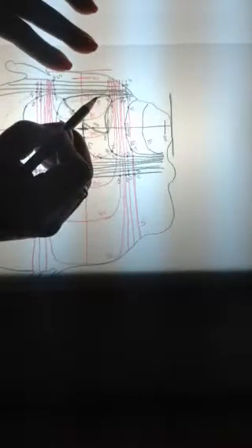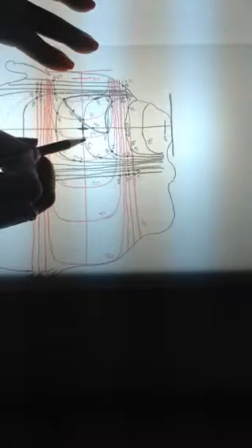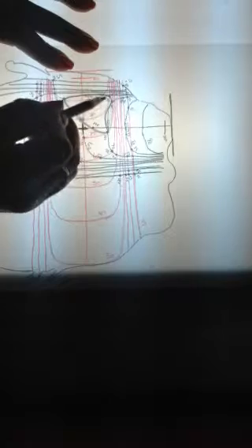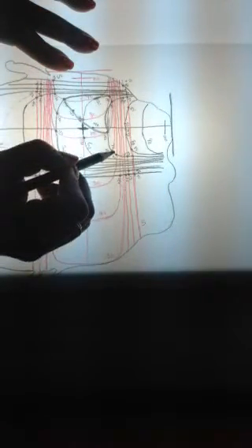And I could do the same thing with 150, although I've only found one section of 150. I would do the same with the 130 percentage dose points. Here's 130, 130, 130, 130. Perhaps they connect this way. I'm going to leave that to you to come to that conclusion, and then to see if there's any place over here that's 130. There's a 140. Perhaps there's a 130 in there. Maybe they connect in the same fashion.